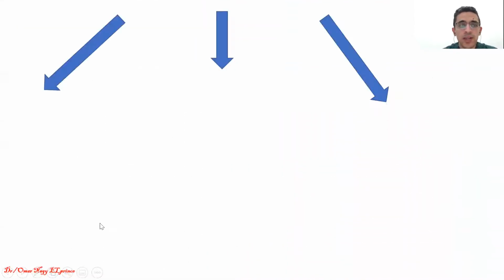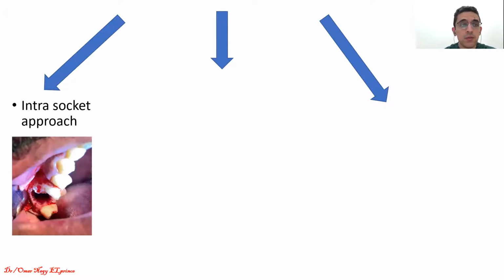So we have to know ان احنا عندنا general approach. يعني لو احنا عايزين retrieve the implant او ان احنا نجيب الامبلانت تاني من الماكسيلاري sinus to make retrieval, we have تقريبا حوالي 3 approaches. The first one is through the intrasocket approach, which is really limited. يعني انت بتحاول انك تطلع الامبلانت through a tiny hole while maxillary sinus بيكون كبير جدا في احيان كتير. Sometimes it works but sometimes it doesn't work.